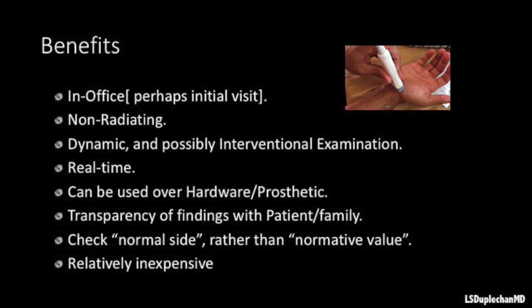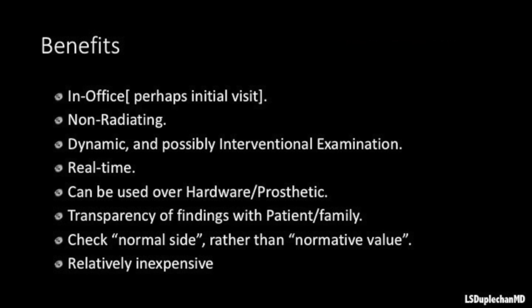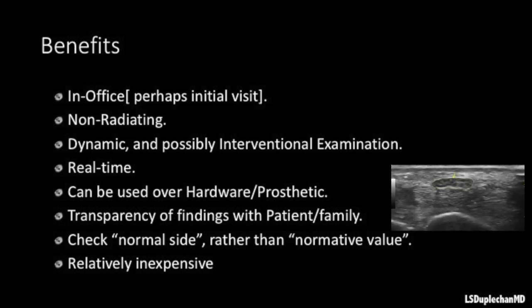Common uses of ultrasound include evaluation of tendons, muscles, nerves, and its use in interventional procedures. Listed are multiple benefits of the use of ultrasound. Highlights of this list include portability, the use of non-radiating waves, and its relative low cost.